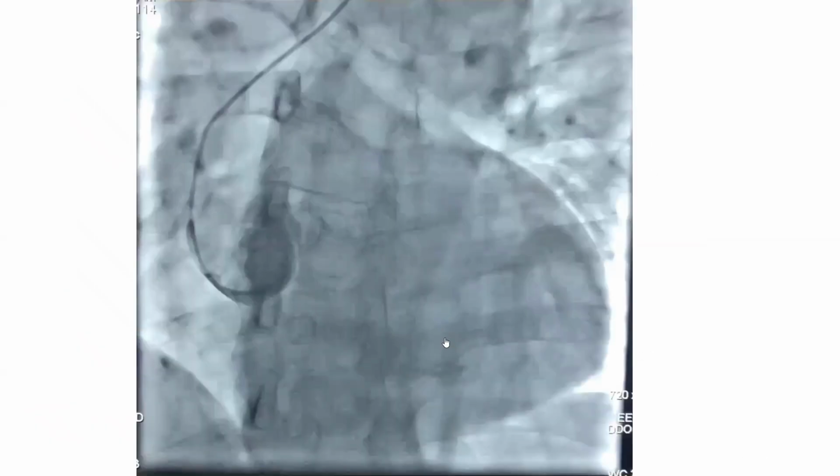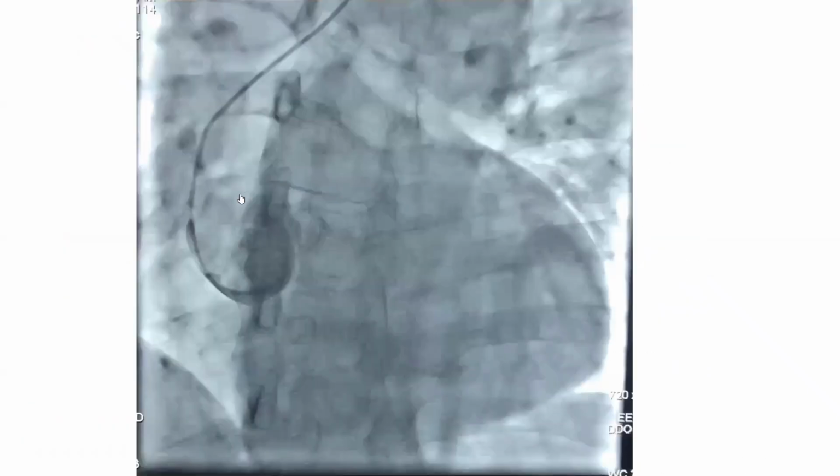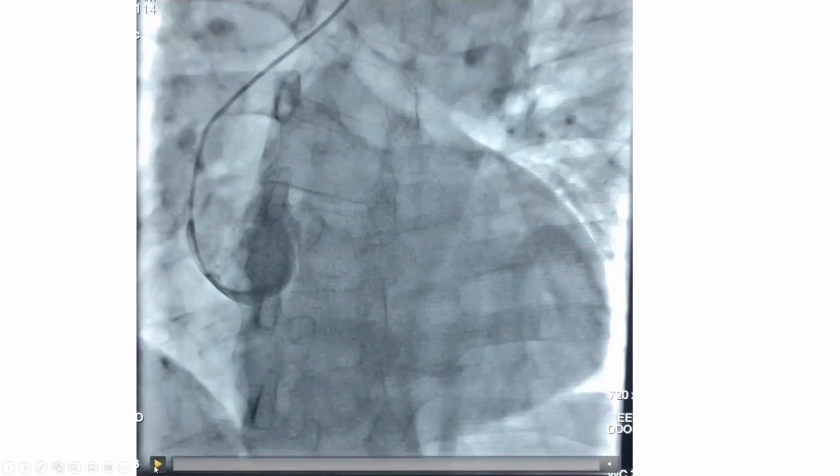And how can I prove AI? Well, we can use a somewhat quantitative method. In the cath lab, when you see something like this, you can keep going and do an aortogram, which is semi-quantitative, as opposed to echo, which uses velocity. Here we're using volume. We're not quantifying the volume. That's why it's semi-quantitative. It's based on eyeball and contrast density.